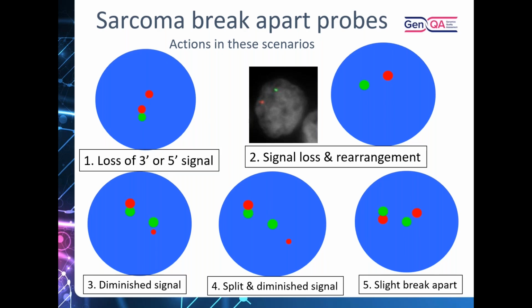I've put 5 different scenarios here with sarcomas, building on what was mentioned previously. So these are the kind of things that don't just crop up in EQAs. We do tend to chuck them in EQAs, but they do crop up in real life. And I've chosen to use my homemade pictures here because it's always quite difficult when you see things in real on an actual screen. So scenario 1 there, you've either lost your 3' or your 5' signal. We've already seen this sort of picture before. So just a couple of opinions really. If you found this on a break apart probe, say it was EWSR1, what would be the typical course of action if this was the majority profile that you were seeing? So yes, you've got a breaking apart, but you've lost one of your signals.